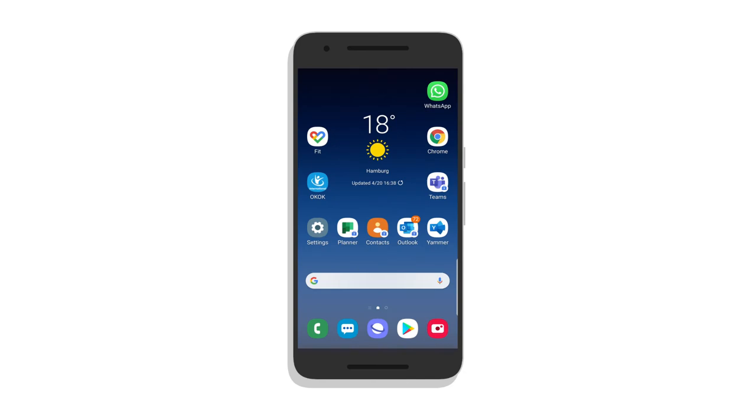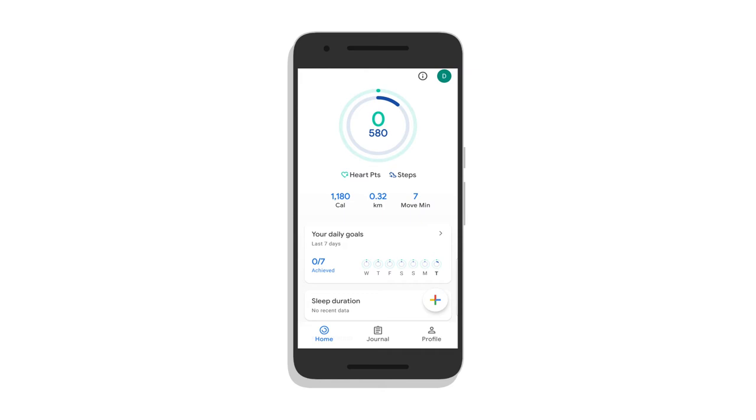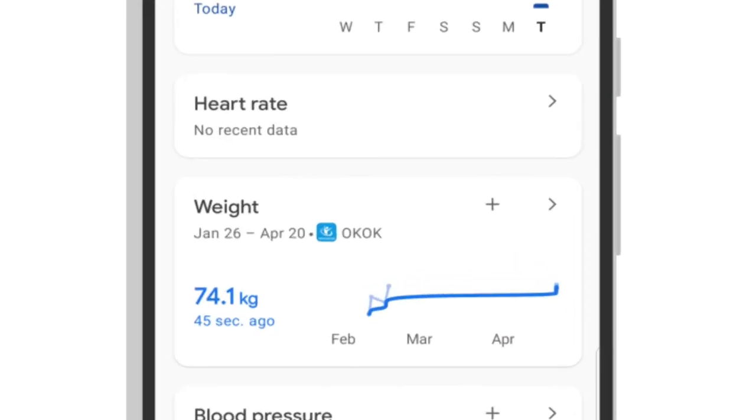Once I open Google Fit, I can see that among other parameters — all the things that Google Fit measures — I have my weight. It's telling me it's coming from the OKOK app, and I weighed myself 45 seconds ago.